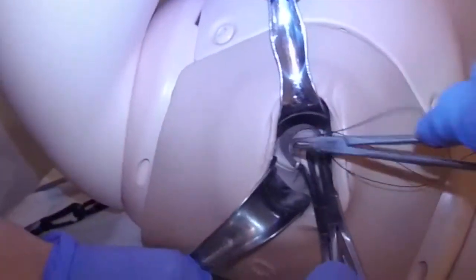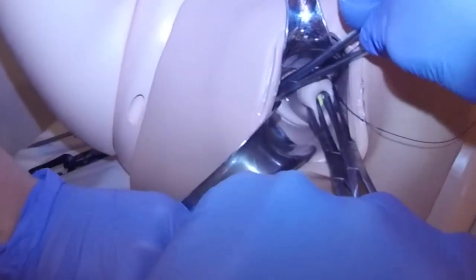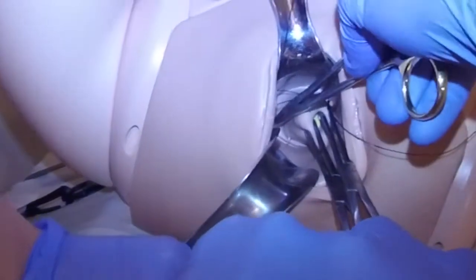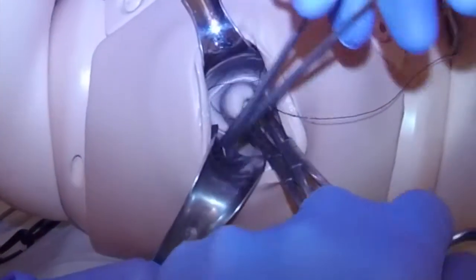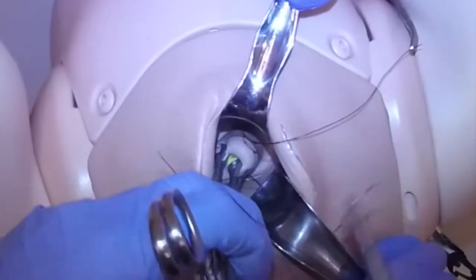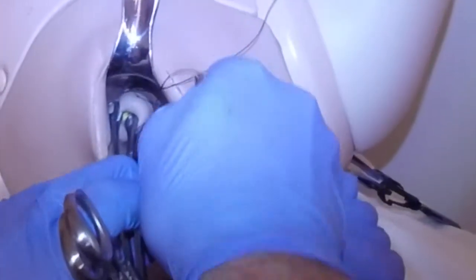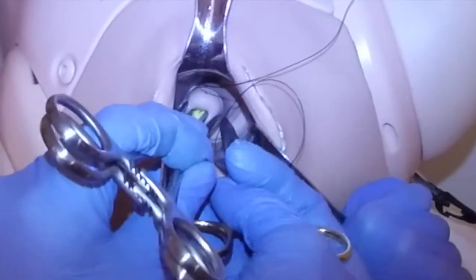I'm then going to come down this way. I'm going to rotate the cervix a little bit if it will let me, and grab another bite around there — lovely. Then, Daisy, if we go to five o'clock and one o'clock, we can take our third bite, again as high as we reasonably can, into the cervical stroma.